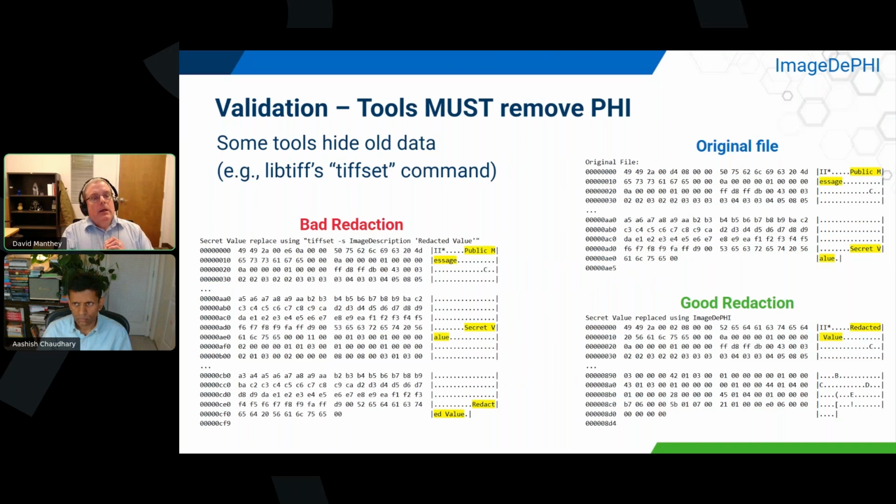And so this slide tells a story. I've simplified it to be as small as possible to show this off. Each of these is a hex dump, a hexadecimal representation with the text data that's within an SVS file. SVS is a type of TIFF, and the TIFF file contains a set of tags. The tag can say, I've got an image description, and then it has those tags stored some way. Then it's got image data, possibly more tags. It goes in different orders. There's a lot of variations in TIFFs.